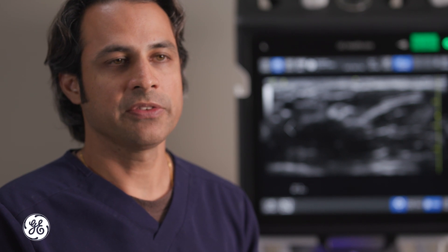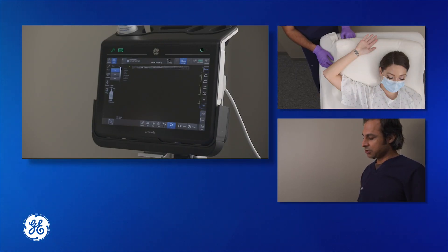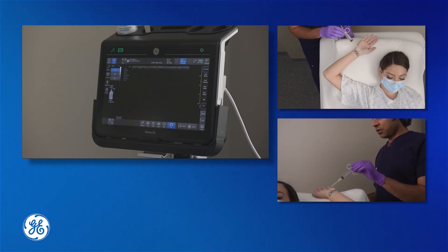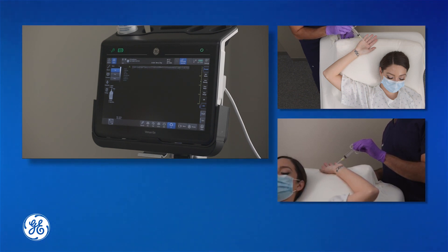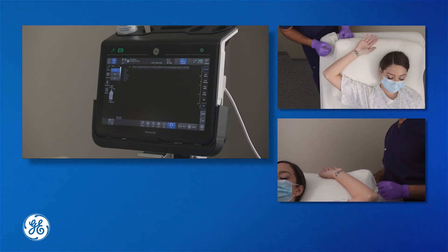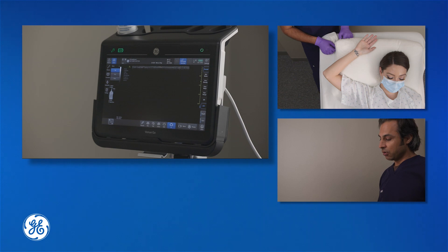In this video, we'll show a demonstration of an ulnar nerve block. An ulnar nerve block is helpful when there is significant injury to the hand or involving multiple digits. It is performed to provide anesthesia to the ulnar region of the hand. The distribution involves the extensor and flexor compartment of the hand up through half of the ring finger, around to the pinky and the remaining ulnar portion of the hand. This is an excellent block for lacerations to the palm or the extensor surface of the hand in this region, or a boxer's fracture.